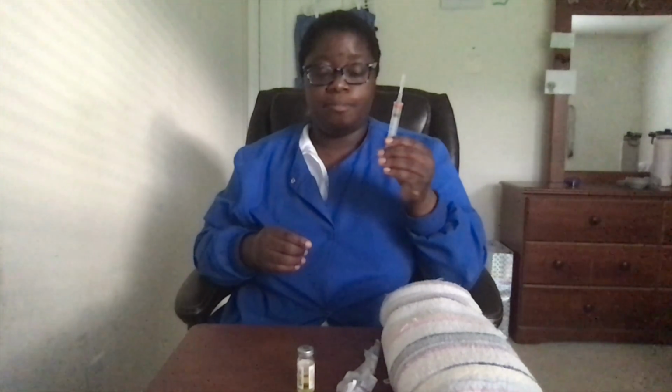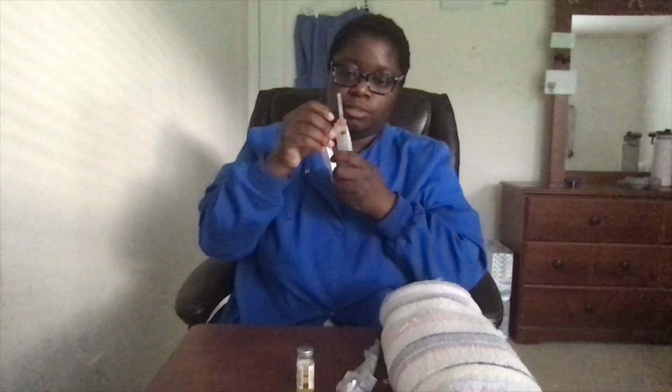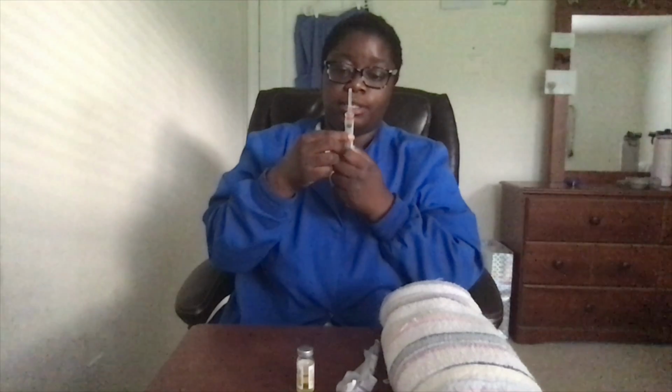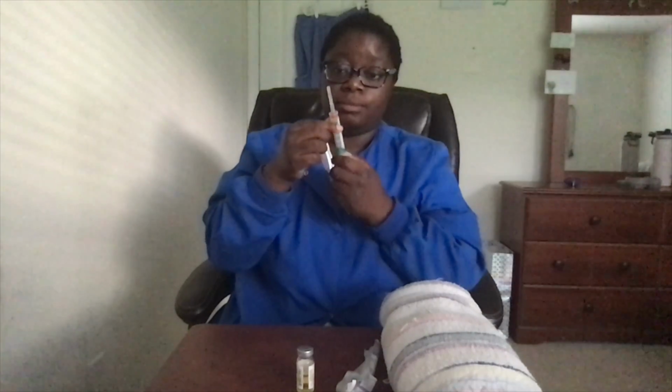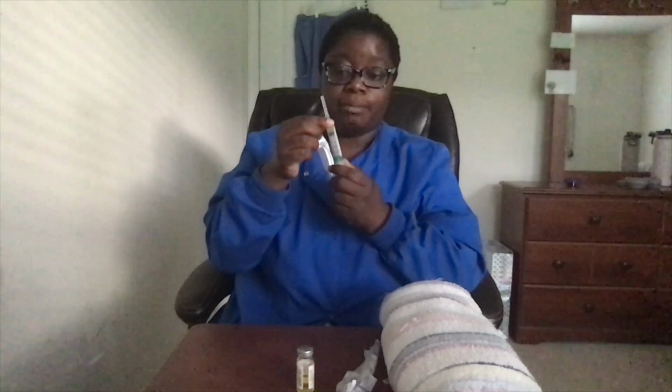Now that I have my syringe, I'm going to label it, being careful not to cover the actual numbers. This label is going to have Anna's name, the name of the drug, the amount, my initials, the date, and the time.